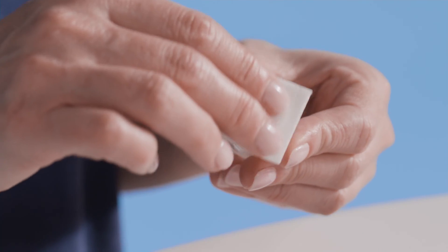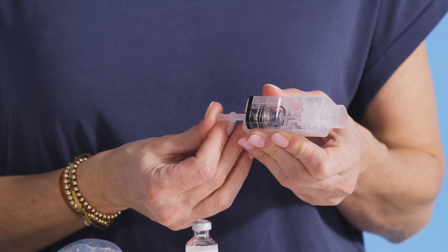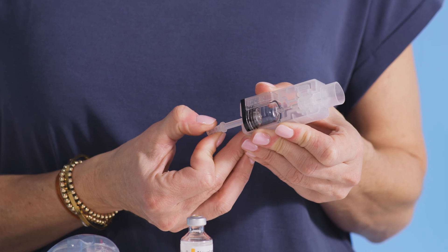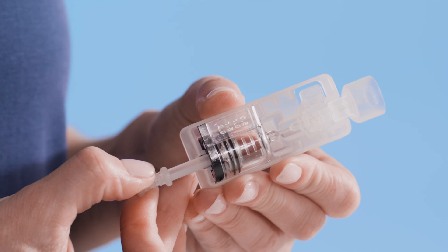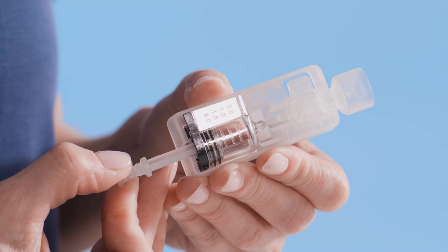First, let's prepare the new cartridge. You do this by pulling down the fill rod and then pushing it back up to force air out of the cartridge. Next, pull the fill rod down to the desired volume. You can measure this by using the top ring on the plunger to align with the desired amount of insulin.